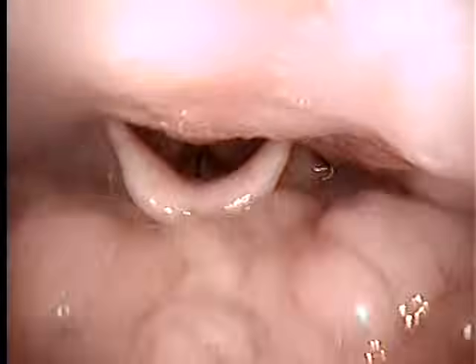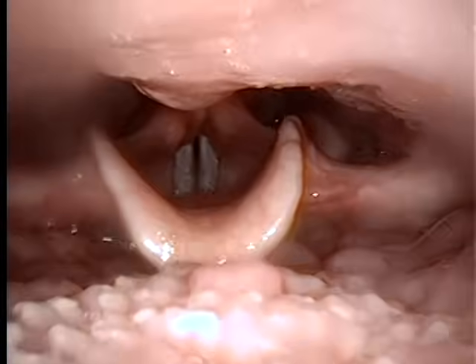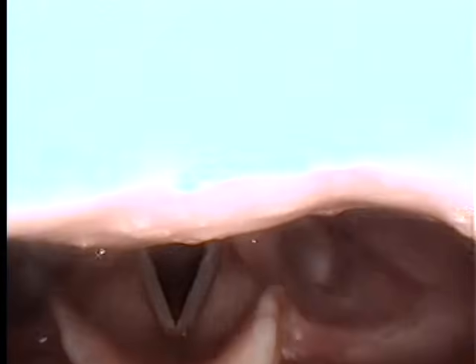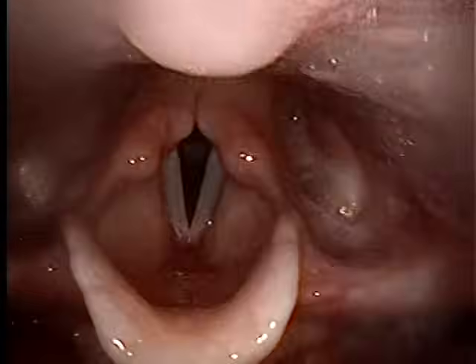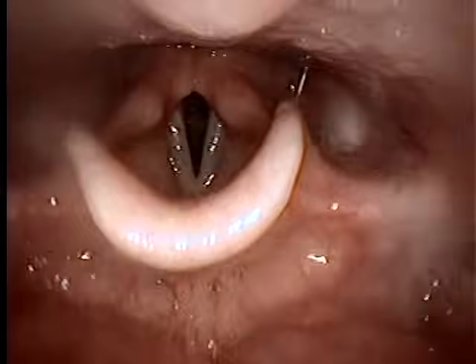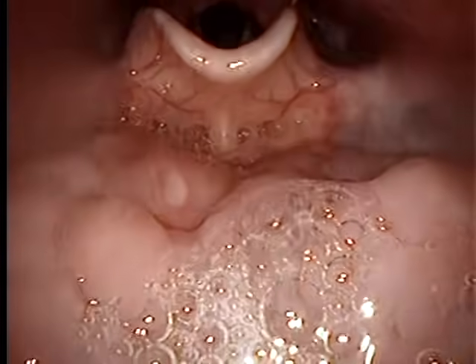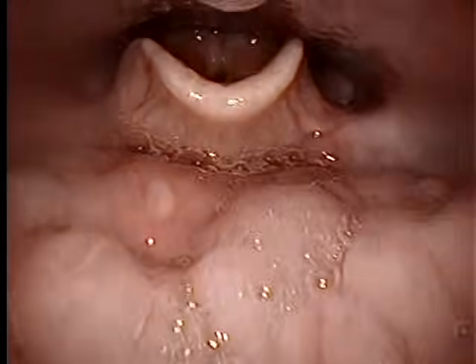You could tell that the top — that's my TA, right? Right. Forward front vowels. Like ah. I'll do ah. So you can't really see it when I'm doing the belt, full belt. The epiglottis is coming up, it's coming back. Look right here — this is your base of tongue. You see it kind of right there, you get into your taste buds. So that's pulling back as you do that more, it's pushing a little bit more and it's making it difficult for you to see.